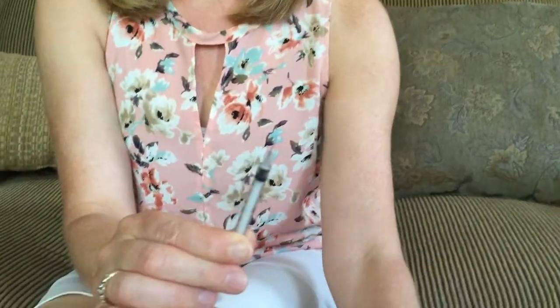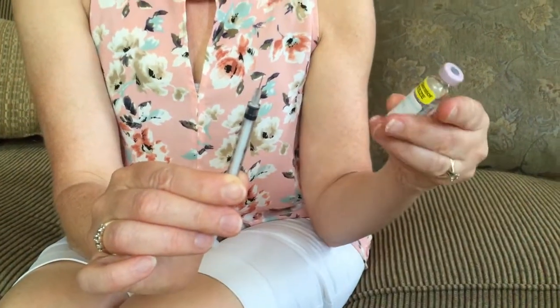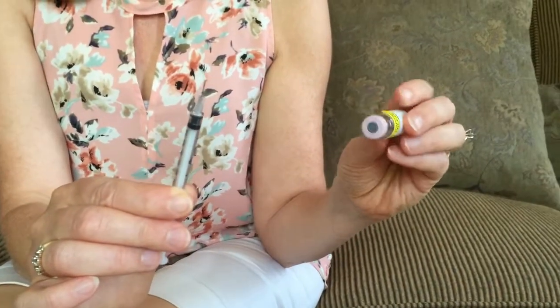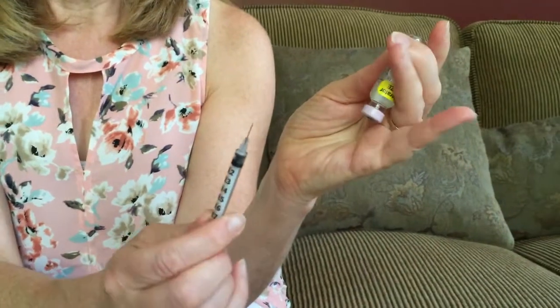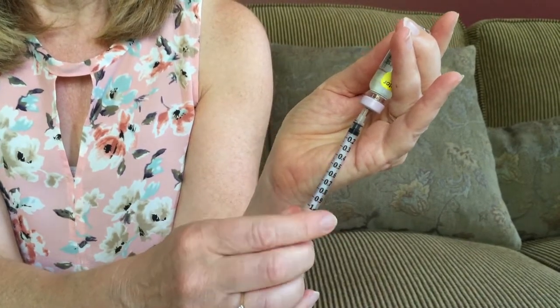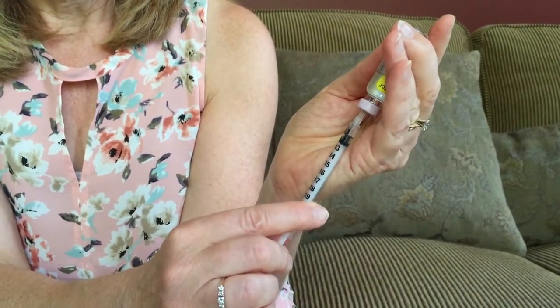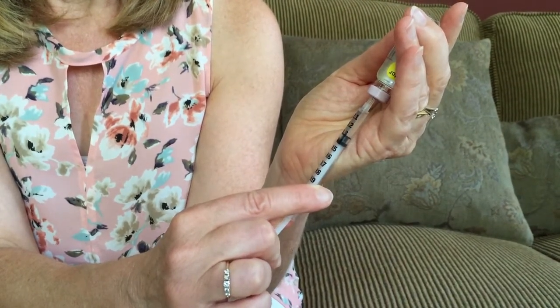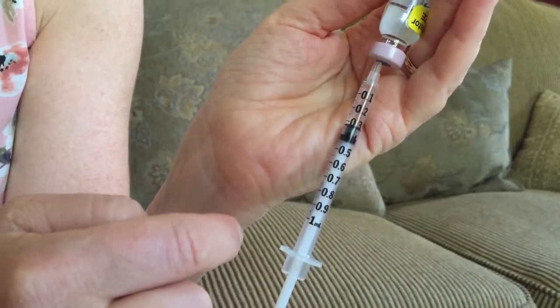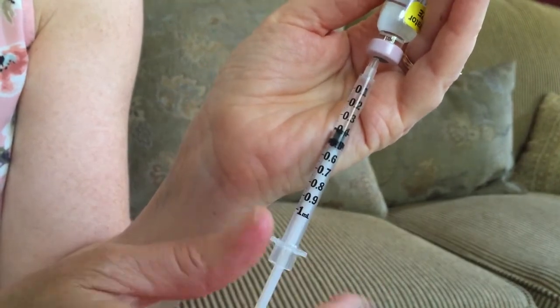So let's go over how you will prepare the syringe to give it to your dog. You're going to take the cap off of the syringe. You're going to take the vial, and just for the purposes of this demonstration, I'm going to use vial number 1. You invert the vial, hold it in your hand, and then you're going to push the needle up through into the fluid. Now, you're going to draw back. Initially, you're going to start with the 0.1. You always want to draw more than what you'll need. So I'm going to draw back, and it really doesn't matter. I'm going to draw it back to about 0.4.